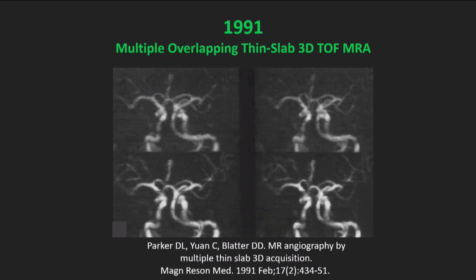And just absolutely transformative work that lays the basis for much of the non-contrast carotid and intracranial angiography that's still done today. In fact, we haven't seen the volumes of these procedures actually go down at our institution. That's still done routinely.